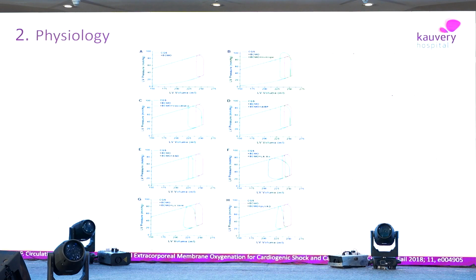There are several ways, some of which we apply routinely. On the left top, you can see the patient; the violet indicates cardiogenic shock, and the red indicates ECMO when that is instituted in the setting of cardiogenic shock, and that is how ECMO improves cardiac output in this situation. But you will notice that LV volume has actually increased while ECMO has been instituted.